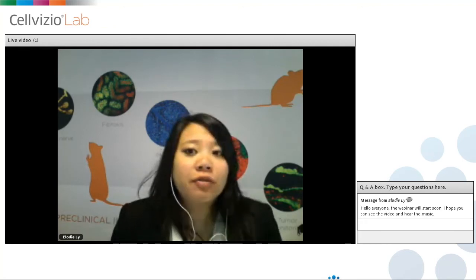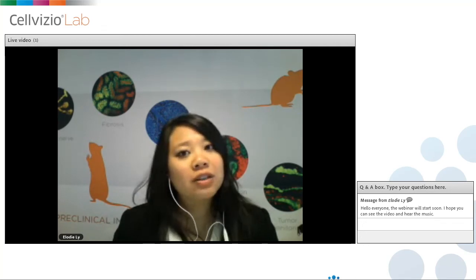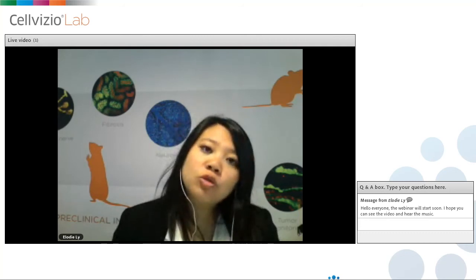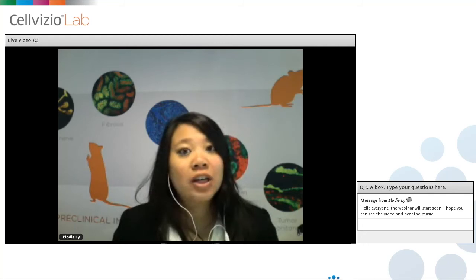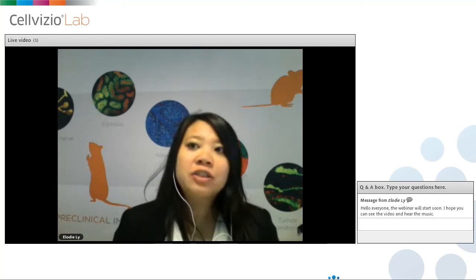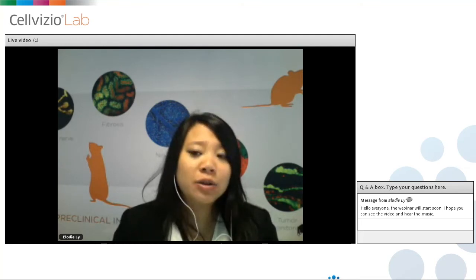If, for example, you want to just highlight vasculature, you can choose a high molecular weight dextran so that it will remain within the vasculature. If you want to look at phenomena like extravasation, then you can choose a smaller dextran size so that it can extravasate. So FITC dextran, you can inject it using IV, and it will fluoresce with the 488 nanometer laser.